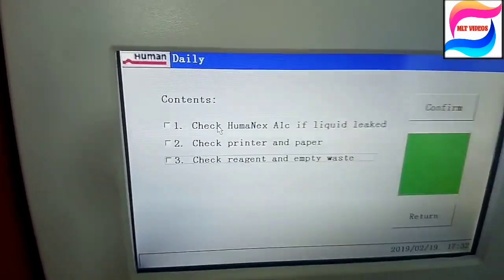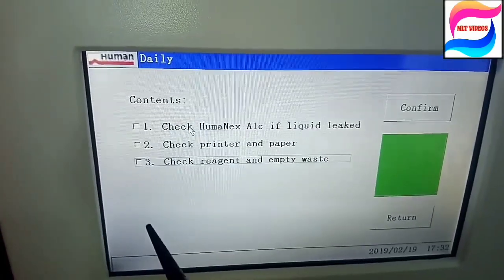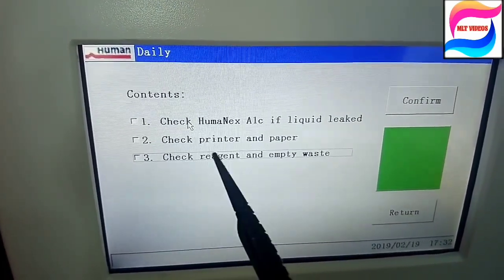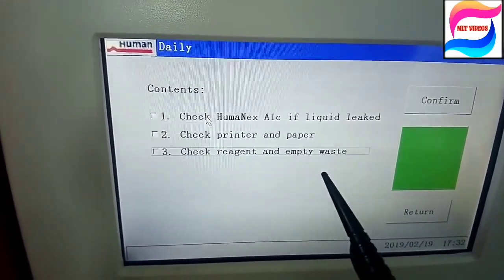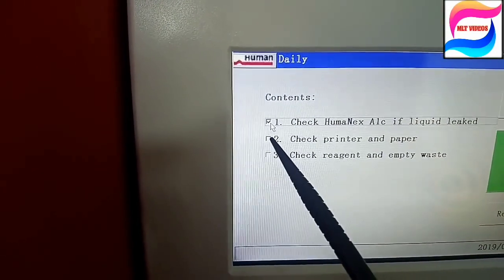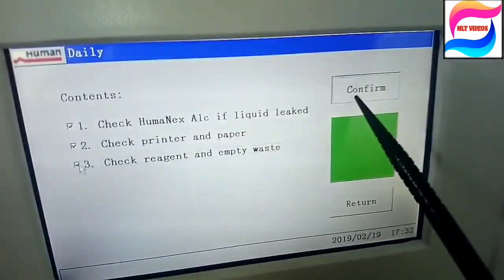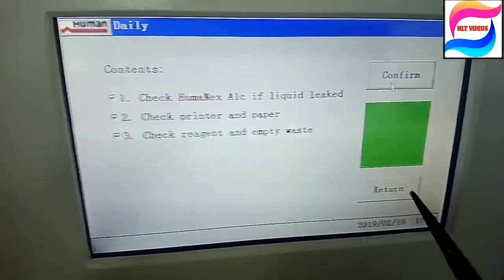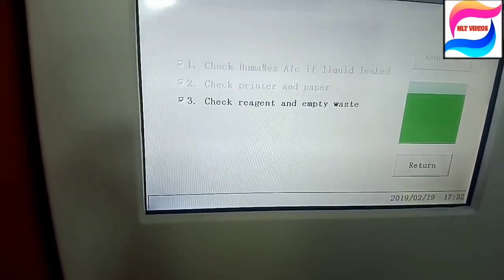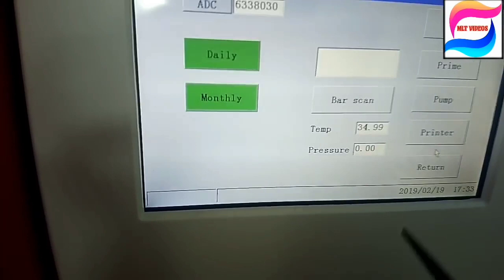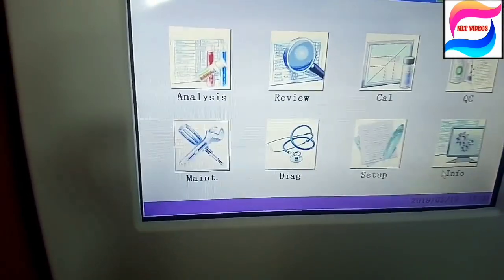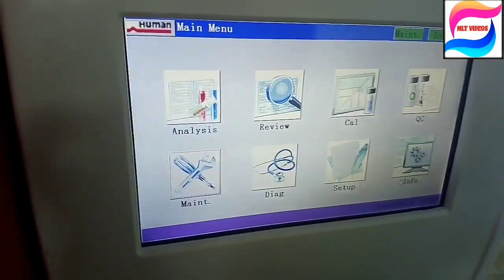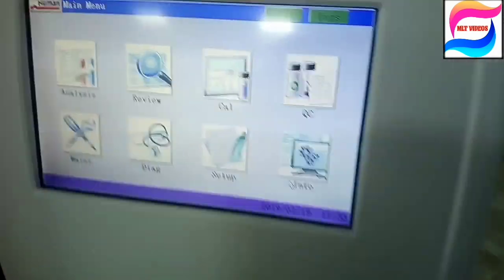There are two types of maintenance: daily and monthly maintenance. That is very easy. In daily maintenance just we will check if any leakage, printer, or reagent empty and just we will mark here printer on the top. And just we will mark and we will confirm and then we will return. That is daily. And in monthly maintenance also that is very easy maintenance. Just there is one column we have to check that column and we will do the monthly maintenance. So that is only the maintenance for this machine.